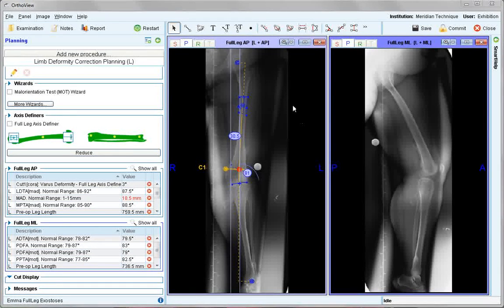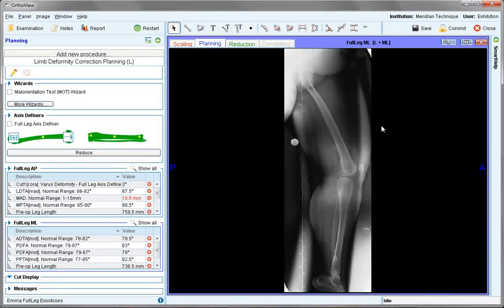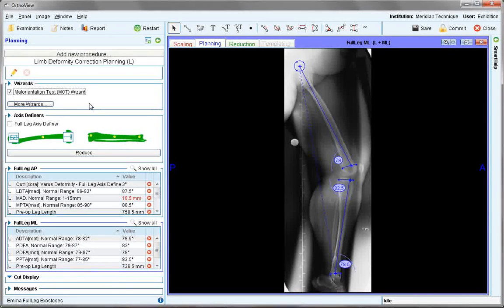The AP image has already been prepared with mechanical axis deviation wizard and axis definers, and the lateral view can also be assessed. This time the malorientation test, or MOT wizard, is selected. This has already been pre-positioned and the position is shown.